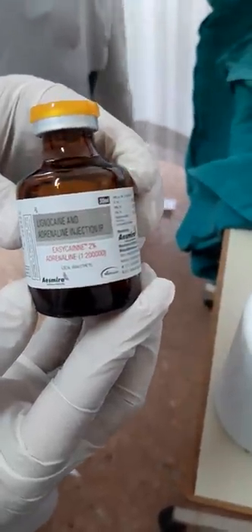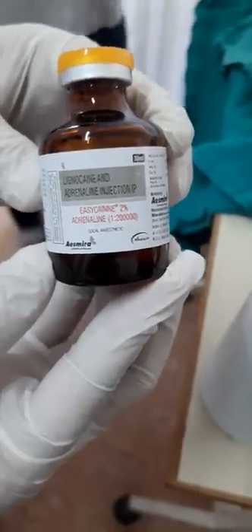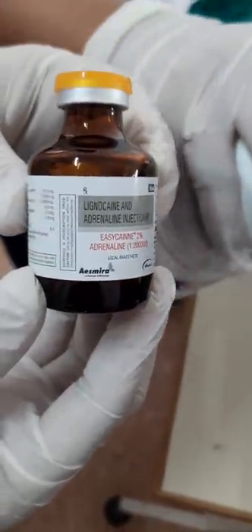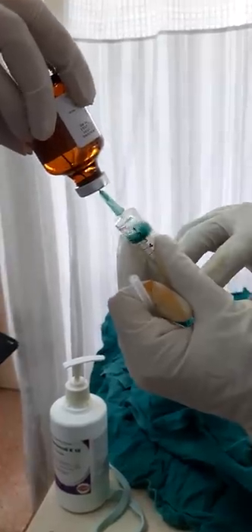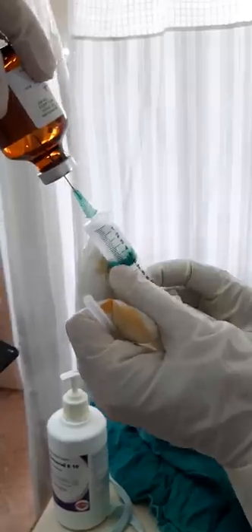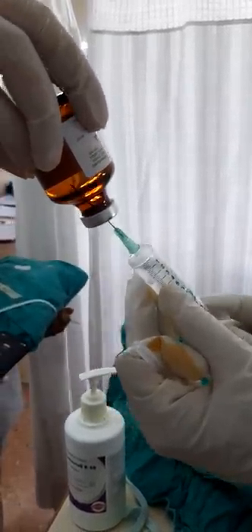Now we will anesthetize the area — the skin and subcutaneous tissue — so that the patient does not feel pain. This is lignocaine; we will take five to ten ml to apply. We will clean the area first, then draw up five to ten ml of lignocaine using sterile technique.